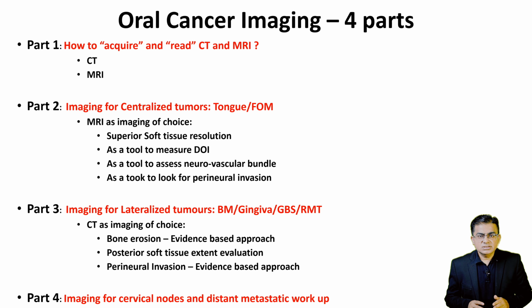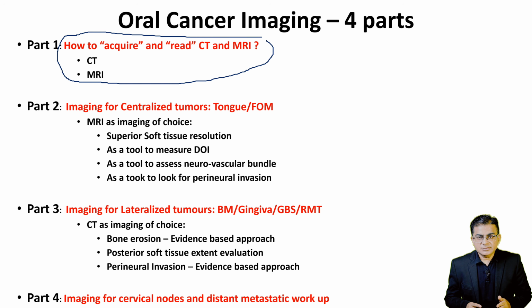But the clinical scope of this topic is massive. Trying to teach you all about imaging of the oral cavity in one single lecture will be useless. You will just get cognitive overload and retain nothing. To make this actually work for you in clinic, I have broken this topic into 4 distinct modules. Part 1, which you are watching right now, covers foundations and acquisition protocols of imaging. We are going to establish exactly which CT and MRI sequences you must demand from your radiology department so that you do not make a geographic miss.